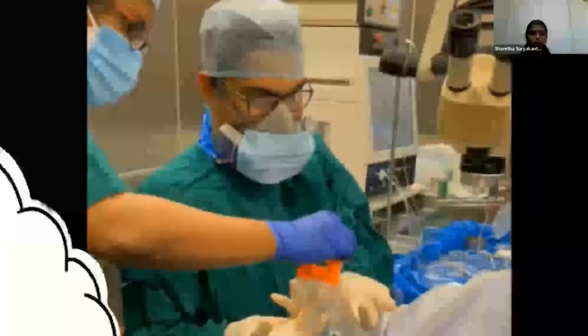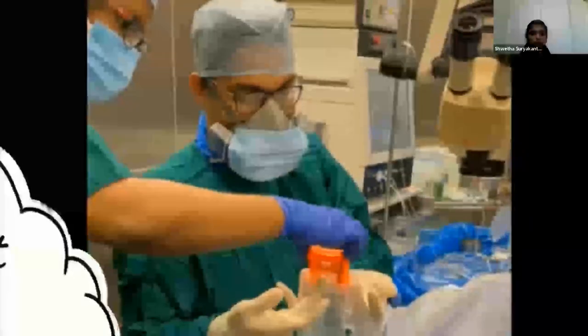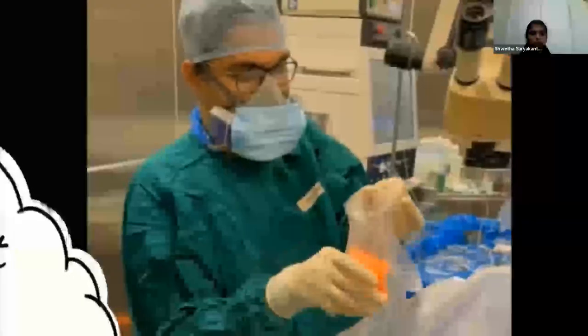We put a general purpose magnet in a sterile plastic glove, covered it well, and took an intraocular forceps and tried to magnetize it by gently stroking it over the magnet multiple times in the same direction. We also magnetized an MVR blade in the same direction. And then we proceeded with the surgery.